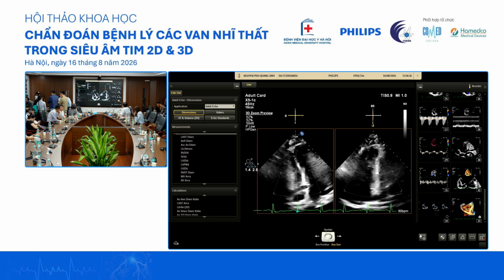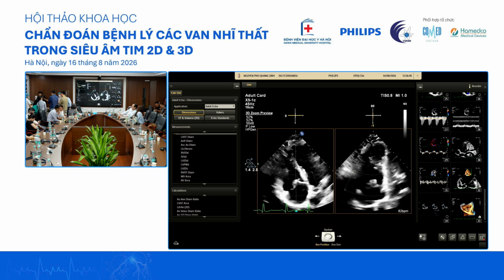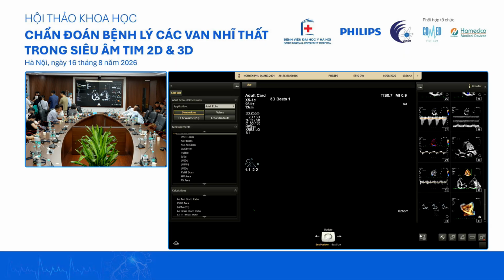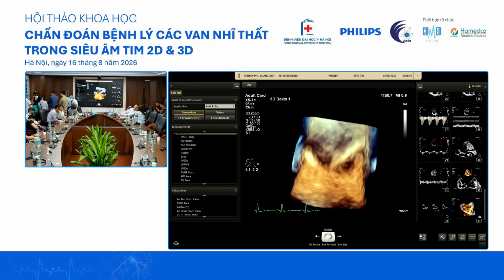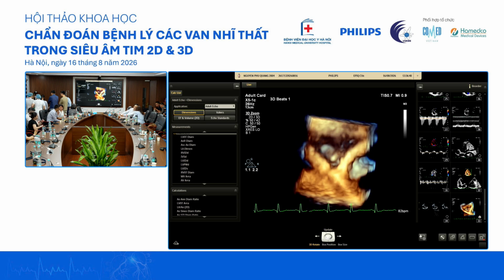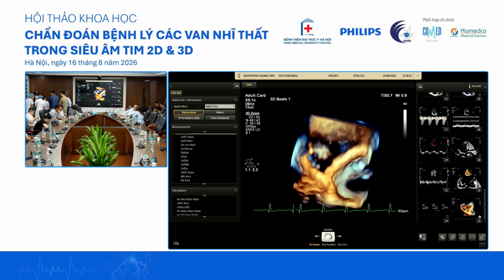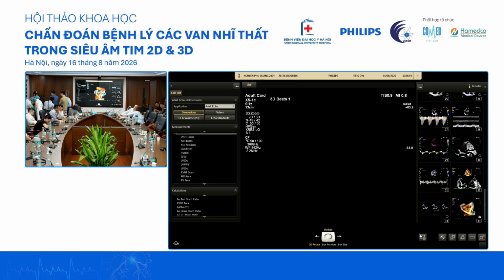If you don't capture, you can also do live 3D. Let's try this. Good. Point the arrow down to the 5 o'clock. Okay, that's fine. Turn on the color.